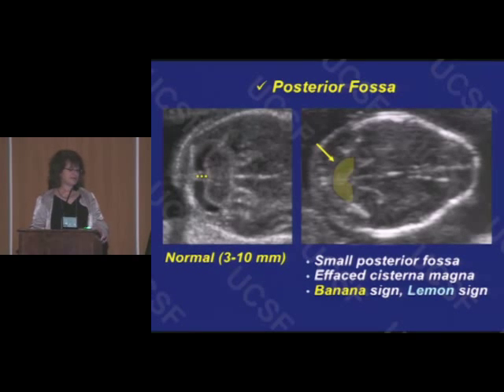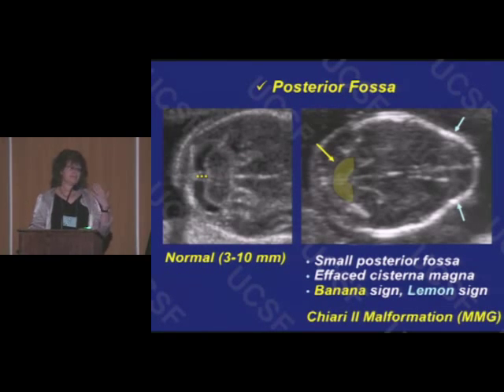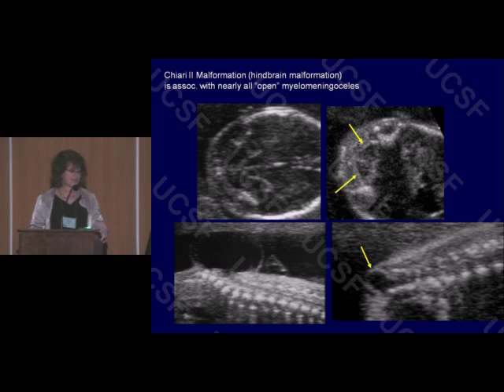An additional observation you might make transiently typically is bifrontal concavity, which has been referred to also as the lemon sign. I think these nickname signs, again, should make you look for those features and then describe them medically. What we are observing are the sequelae of a Chiari-2 malformation, and once having made that observation, we're going to go looking and basically not hang up the transducer till we find the highly suspected distal spine abnormality, the myelomeningocele, with which Chiari-2 malformations are so strongly associated.